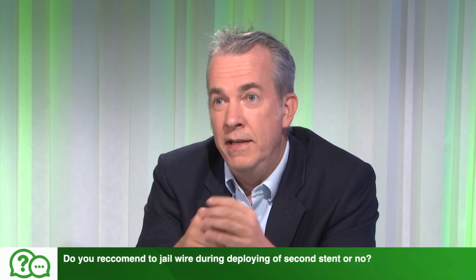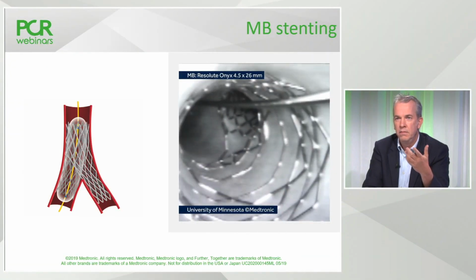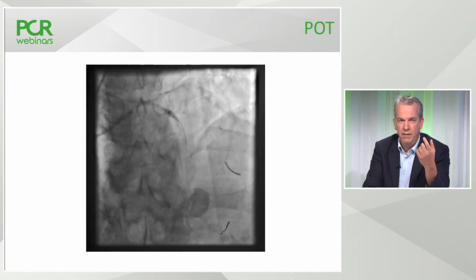I don't recommend it, and I always used to take it out, but then I forgot a couple of times, and it seemed to be fine. So I don't really mind. I don't think it seems to be much of a problem, actually. I don't know if you agree. Yes, usually there is no issue to remove this wire, but of course this wire is no longer useful, so you can remove it. Yes. And probably only once you've done the POT could you really squeeze it tightly. But anyway, this second POT is the bit which people often forget.